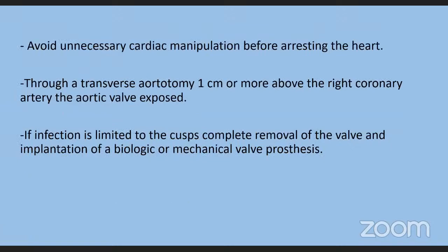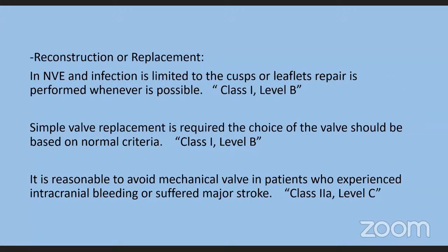So avoid unnecessary cardiac manipulation before arresting the heart. We're going to avoid embolization through a transverse aortotomy 1 centimeter or more above the right coronary artery. The aortic valve is exposed. If the infection is limited to the cusp, complete removal of the valve and implantation of a biological or mechanical valve prosthesis is reasonable. So, reconstruction or replacement.